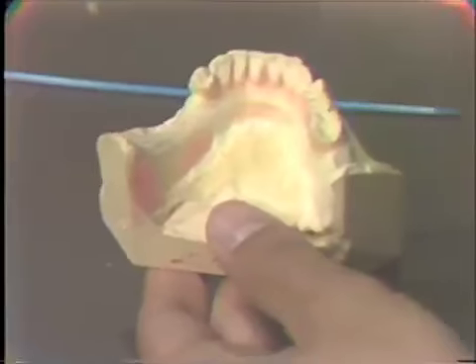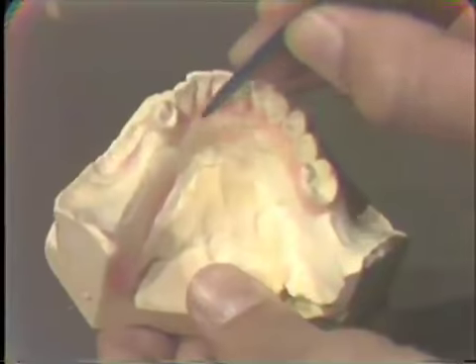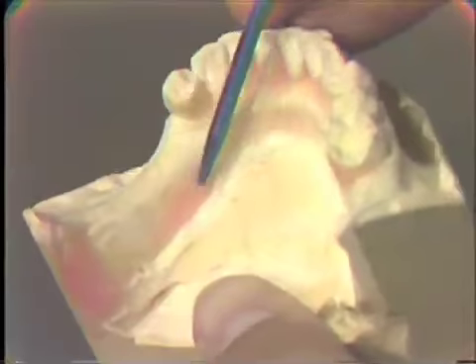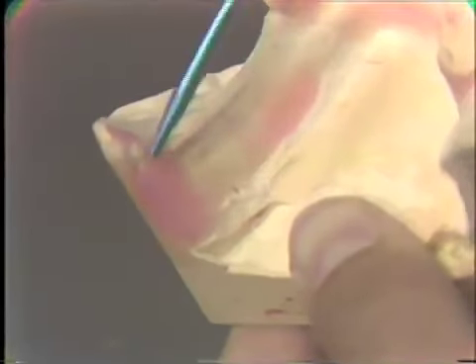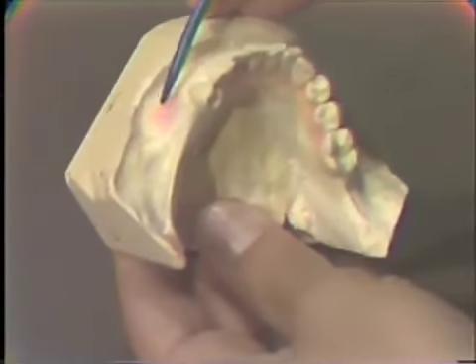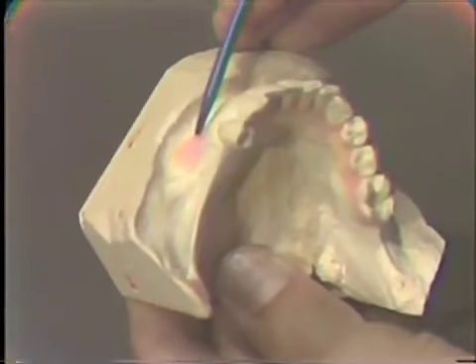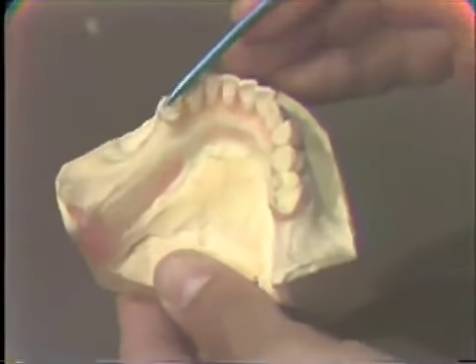We would add it with a spatula, and we would block out any undercuts on the cast, particularly around the cervicals of the teeth, any areas of the ridge which would happen to be undercut, particularly in the very posterior, just lingual and inferior to the retromolar pad in the lateral throat form area, and possibly just under the terminal abutment tooth on the free end saddle side. Those are specific areas that you can look for, but obviously every mouth will be different.